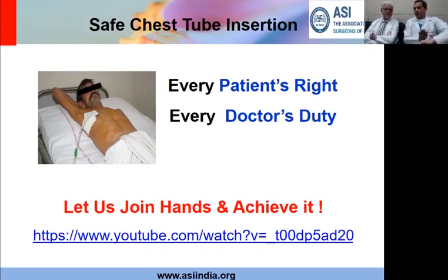That's number one. If the patient is having an air leak, then it's an emergency that you put the tube in as quickly as possible. But if the patient was not having an air leak, then you could take time. At the most, fluid will collect. And then you would take the patient back to the ward or theater, be comfortable, and put a chest tube in again from a fresh site, unless it was just maybe 24, 48 hours and this wound is still fresh, then I may possibly use the same wound. But otherwise, if it's many days old, I would go for a new wound.